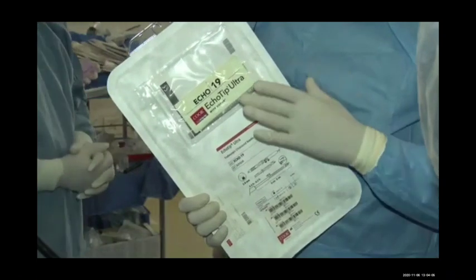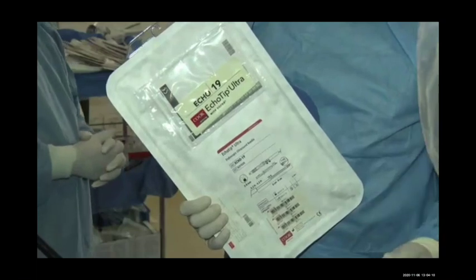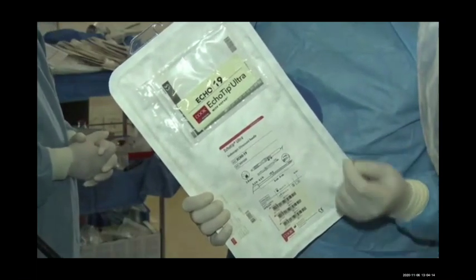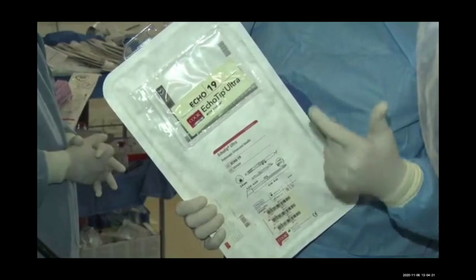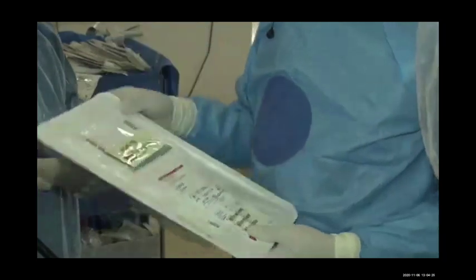And the needle stylet should be removed, and it should be flushed with distilled water or with 5% dextrose. Avoid normal saline, because it produces coagulation of the glue inside the needle. So one important point, I use a 19G needle. I keep one extra along with me. I try to flush, so we always remove the needle stylet.